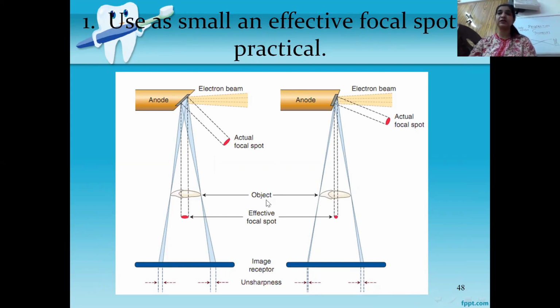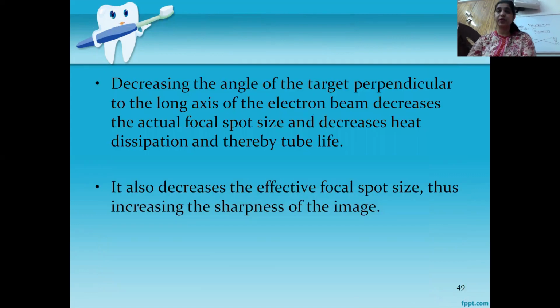So we should keep the angulation more parallel as compared to vertical and horizontal to the film that we have to take of our object.